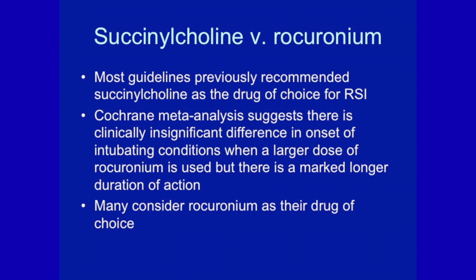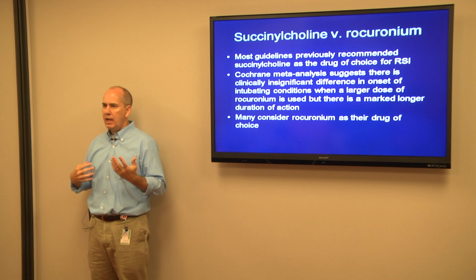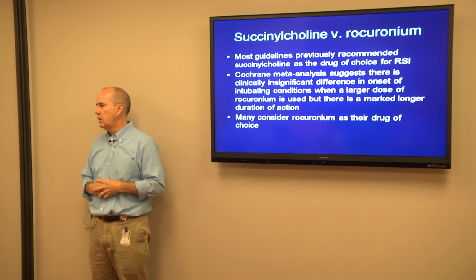But I've always felt that whether you're paralyzed for 8 minutes or you're paralyzed for 25 minutes, if you cannot provide bag valve mask ventilation in the setting of a paralyzed patient, you are toast. All right. So if you can't get yourself out of that, for me, whether they're just a little bit paralyzed or a long bit paralyzed, you're toast.